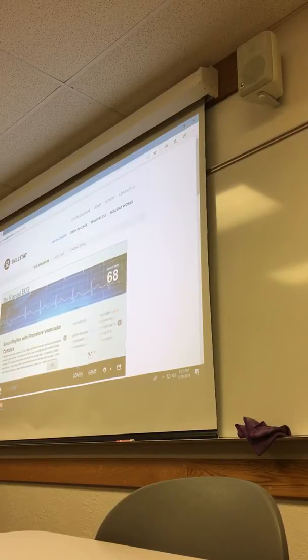We are going back to atrial rhythms. So we have our PAC. Now we have supraventricular tachycardia. This is actually one you will see fairly often. These are ones with an extremely high heart rate. They will go in and they can shock them or give them medication to try and get them back into a normal sinus rhythm. But very, very fast.